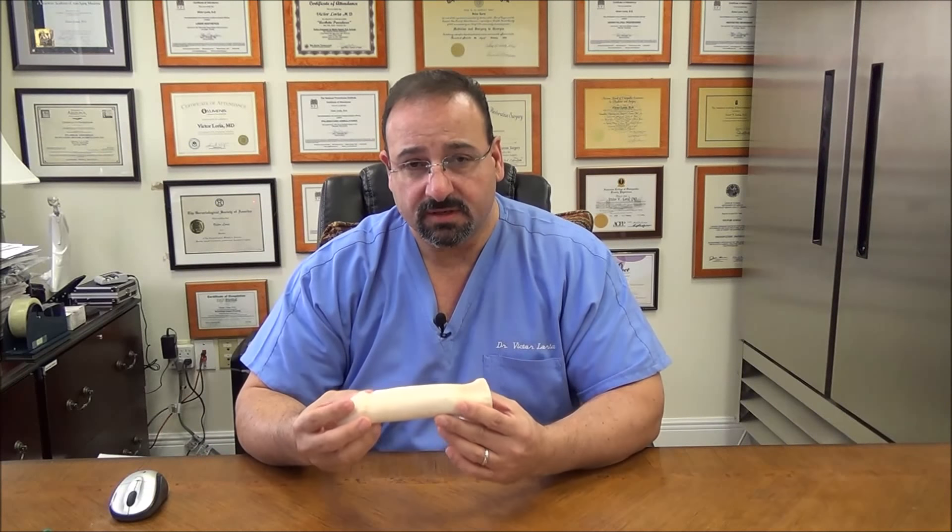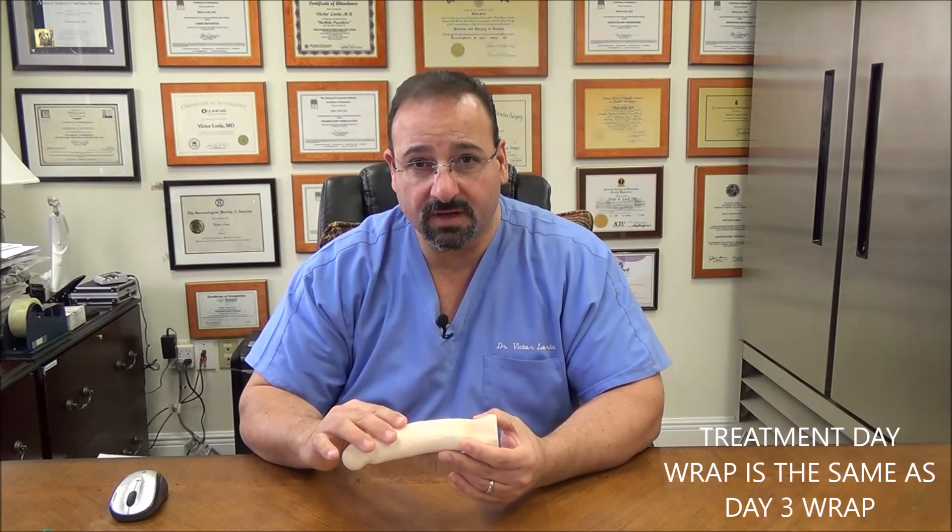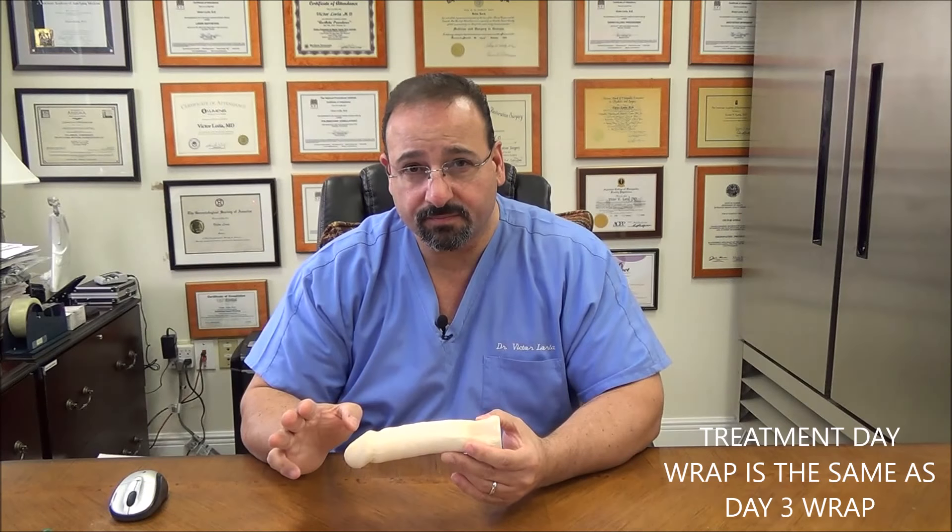This video is going to describe how to wrap. The wrap we're going to put on today is the same wrap you're getting on your treatment day, and it's the same wrap you're going to use on day 3 — three days after your treatment, because you need to re-wrap on day 3. You will re-wrap on day 7, and then every 2 to 3 days after that until day 21. First we'll focus on the wrap for your treatment day, which is the same as the wrap you'll put on 3 days later. Then we'll discuss the differences on the day 7 wrap.